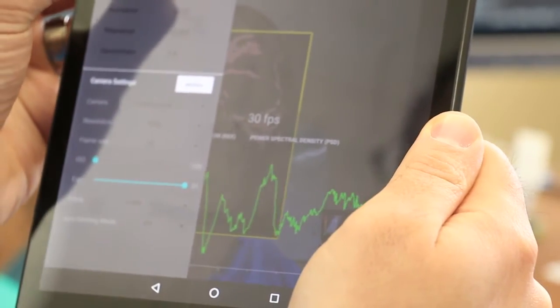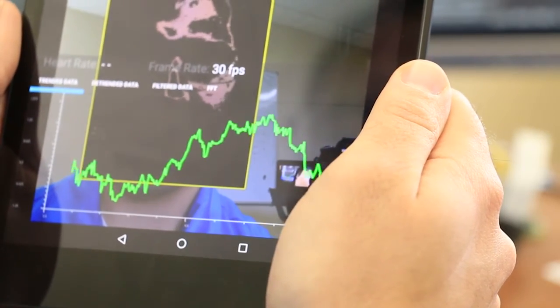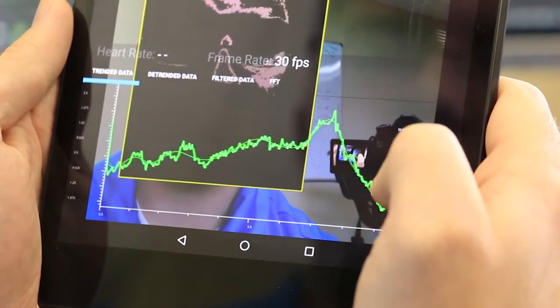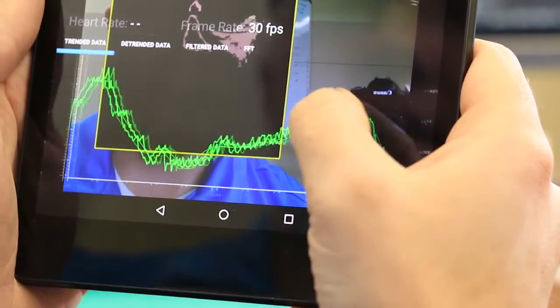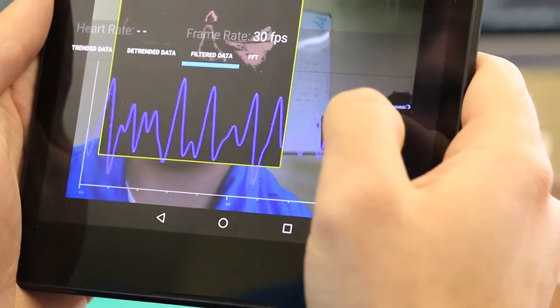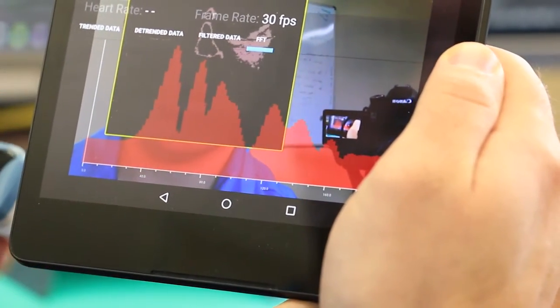So let's move to the second algorithm. This one appears a lot like the first. This is the same data we were looking at before, just the average green channel. But then I actually apply a detrending signal to it. If you look closely, there is a small green signal that appears to be following the average green signal. When I remove that, I get a much cleaner looking heartbeat signal. This isn't the true heartbeat signal, but it's what we're going to derive the heart rate from. So again, I filter that, and I take the FFT and see the spectral information from this way of monitoring.